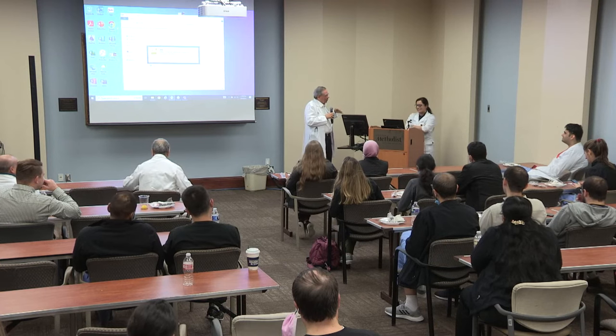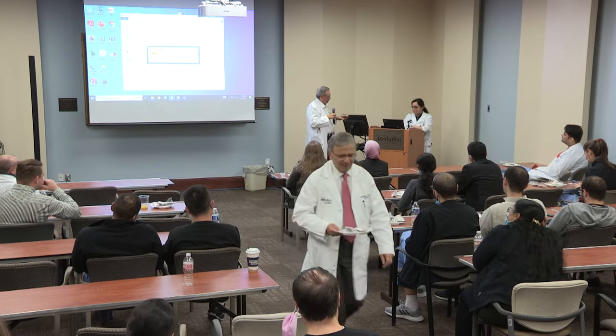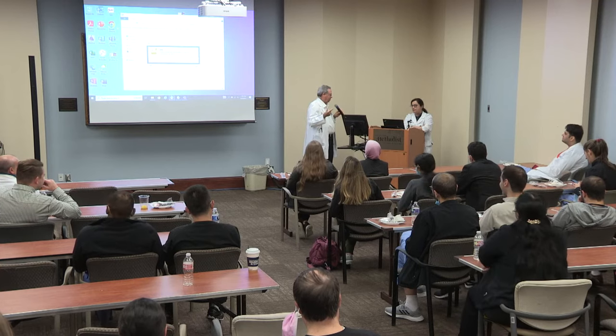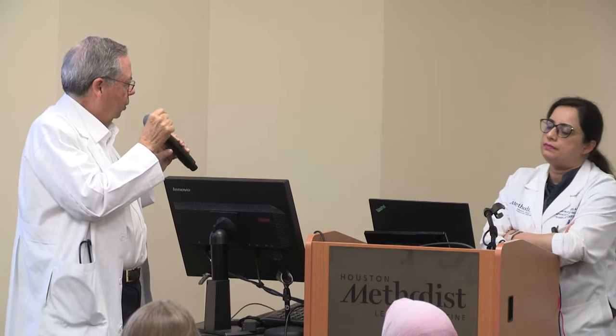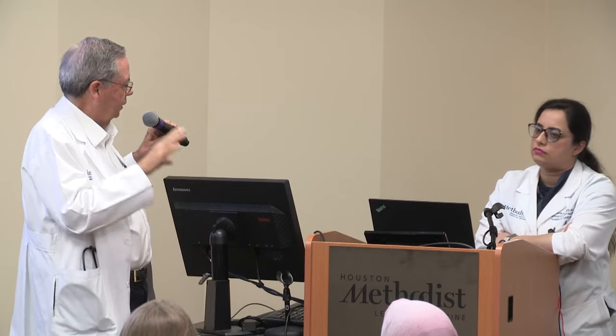So, we have these middle of the night or afternoon or 6 p.m. stat echoes on an LVAD. Portable. Most of the time, image is not that great quality. Help us here. Of all this stuff that you taught us today, what one or two indices do you want from that stat echo? Because most of the time we cannot provide all the information that we would normally want, for all the reasons. Then they use contrast, and with the contrast you can get LV dimensions, but then it's harder to see the aortic valve. So what of everything in that middle of the night stat emergency echo is it that you're looking for?